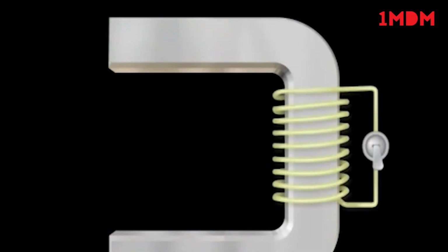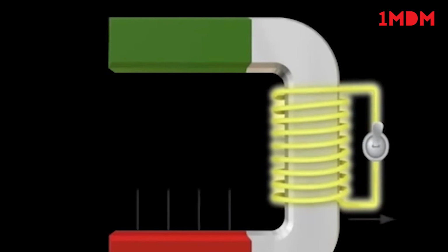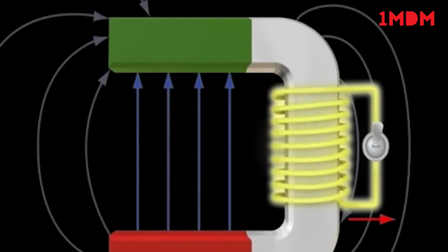With resistive magnets, the field is generated by a constant external current supply. The current flows through the wire coils and generates a large amount of heat, in addition to the magnetic field. This heat is drawn off by a water cooling system. Resistive magnets only generate low field strengths, since they are limited by the ability of the cooling water to dissipate heat. In case of an emergency, a resistive magnet can be switched off at any time.